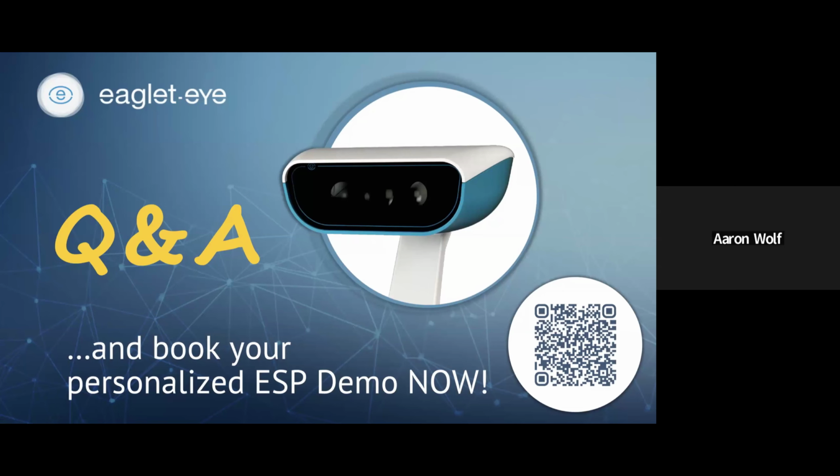Scleral lenses, though, as far as comfort, there are some practical things, like cost, right? A corneal lens will serve people very, very well, but some people have had a bad experience with them in the past, or for whatever reason they're worried about it coming out, or they're very active, maybe with sports or outdoor activities, and they wonder if a corneal lens might not work.